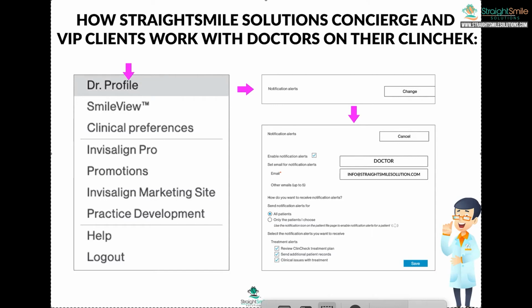But I just want to let you know our core value is not to require you to use this on all your cases. Now, if you just want someone to do it for you and you want to be totally checked out, ultimately, we're not going to hit approve because we're not the licensed doctor. You're going to have to make the final decision. We'll optimize it. We might have questions for you. We still want to stay engaged, but we can do most of the work for you.